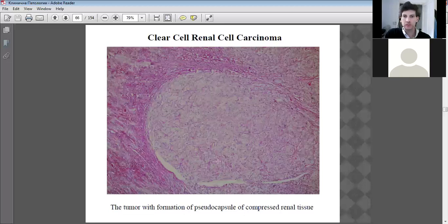Within the mass of the tumor, there are spots of degradation into what we call necrotic tissue. So all the dark spots there are necrosis. And as the tumor grows in size, eventually the central bit starts to necrose. And that causes all sorts of problems with tissue and organ function as well.